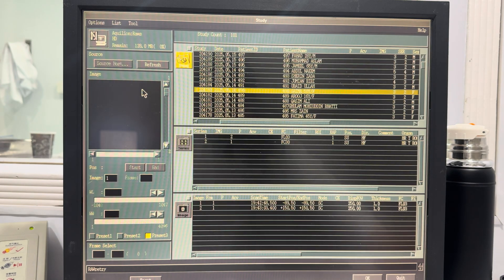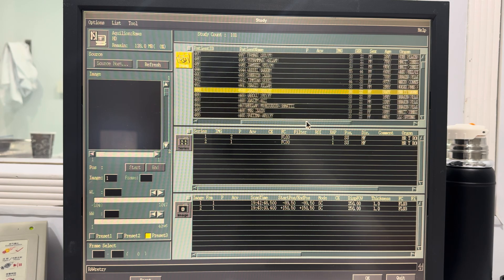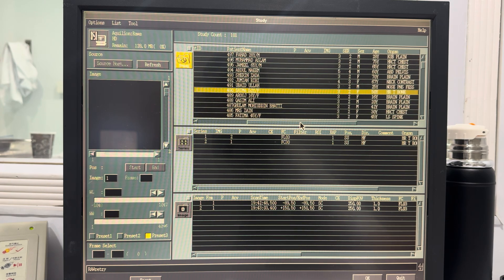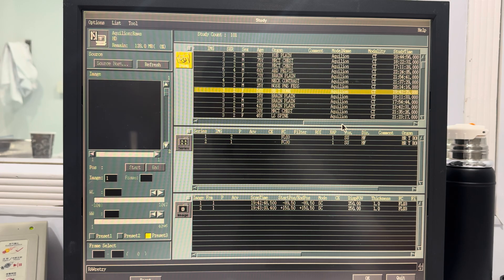First, click on raw data to access the directory. From there, select the relevant patient as demonstrated here. I've already selected the patient. When selected, click on the OK button to proceed.